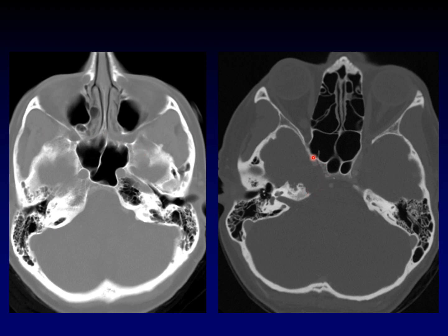Look on this side. There is loss of the normal bone in the medial petrous apex. Look how the internal carotid artery has been displaced compared to its counterpart. This is an expansile mass thinning the bone to a degree of imperceptibility and displacing surrounding soft tissue structures. This is really a huge mucocele, but because it's got blood degradation products in it, it's going to be bright on T1-weighted imaging, and that's what we call a cholesterol granuloma.